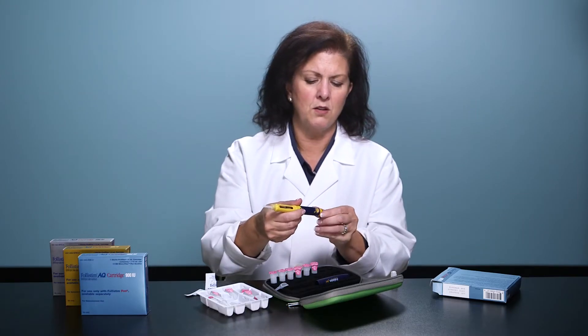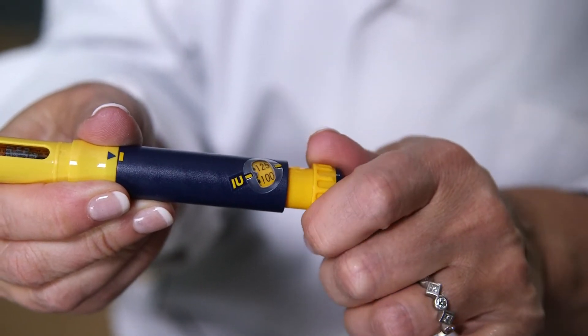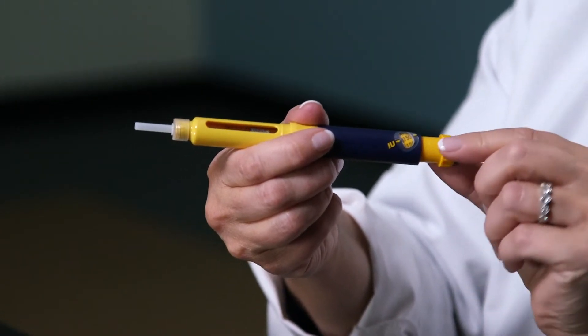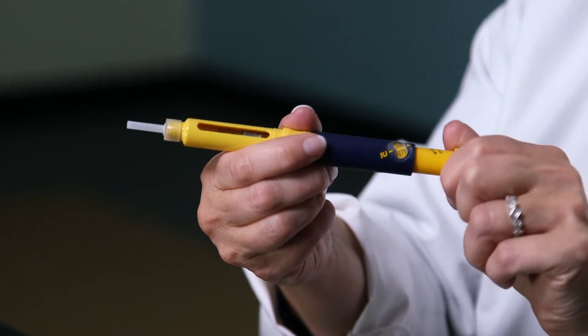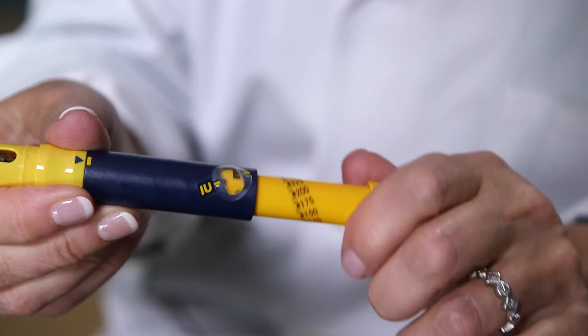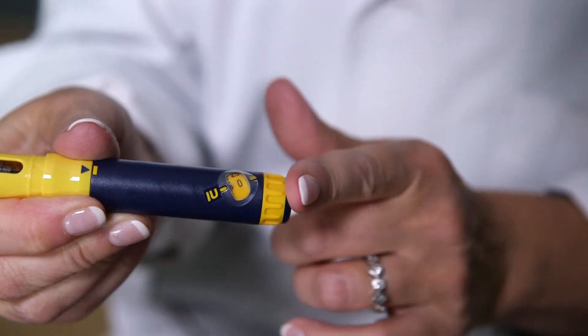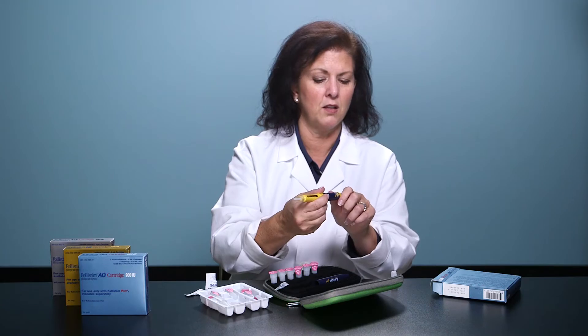The dosage dial is how you dial up your dose. If you over dial your dose, you can't go backwards. If this should happen, scroll forward past the max dose of 450 units — the dosage button will release. You can press back in and start dialing up your dose again.